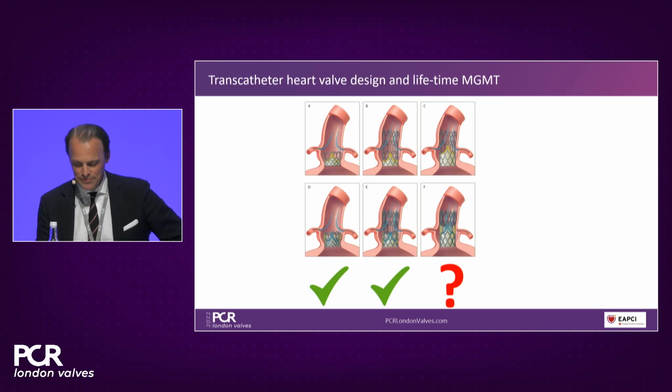No, obviously it's such a complex field, right? It's so different than what we used to think 5 years ago. How much should we oversize? How do we use CT for TAVR procedures, looking at perimeter and area? We were so basic a couple of years ago. We didn't really think about many concepts that we do think about right now.